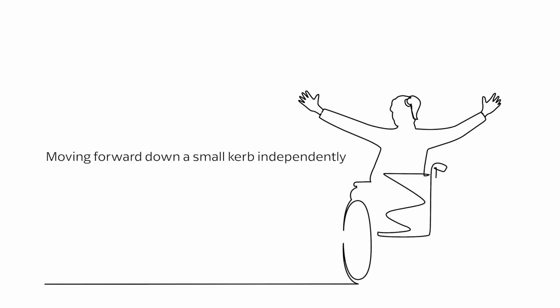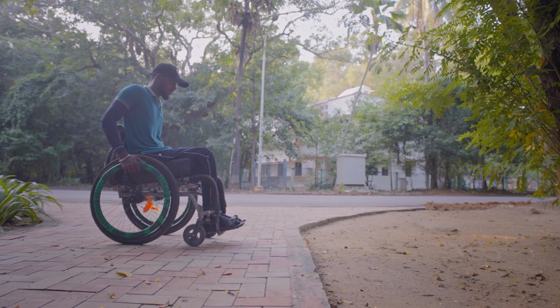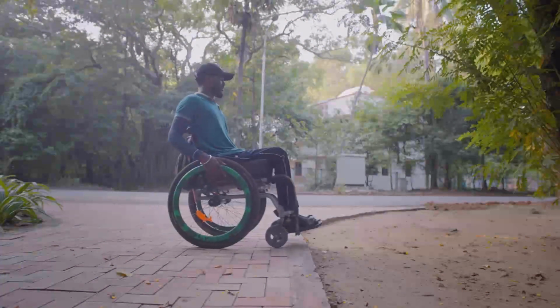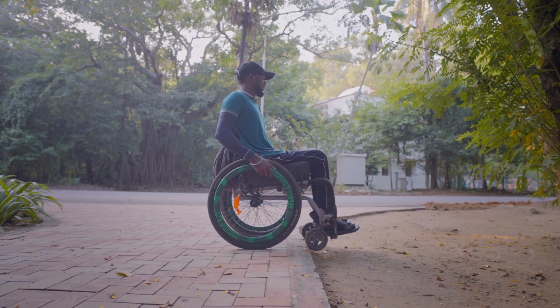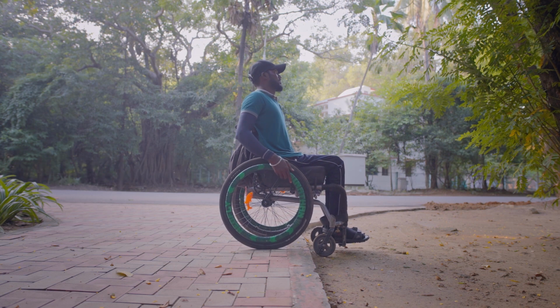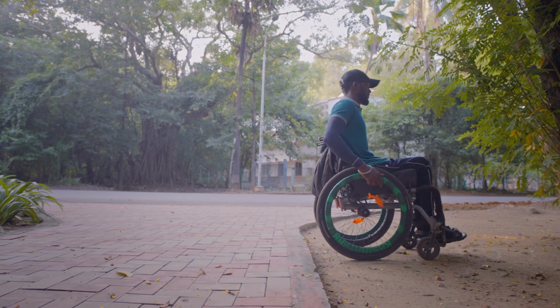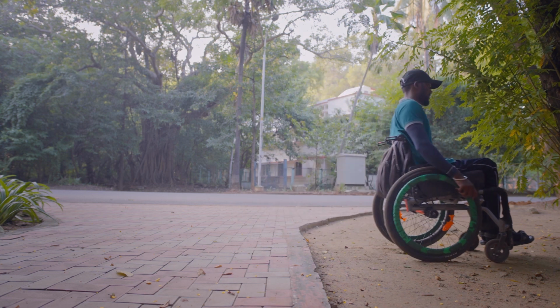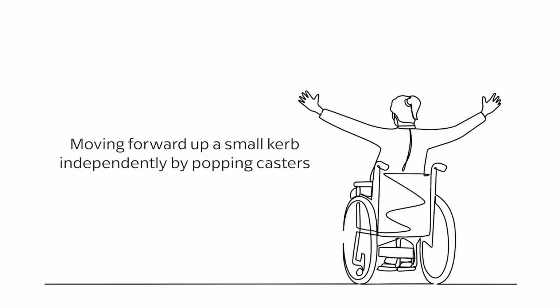Moving forward independently down a small kerb. To go down the kerb independently in forward direction, push the wheelchair forward. Gently lower the casters down the kerb. Now gradually lower the rear wheels down, controlling the amount of resistance given on the push rims at the knee level.